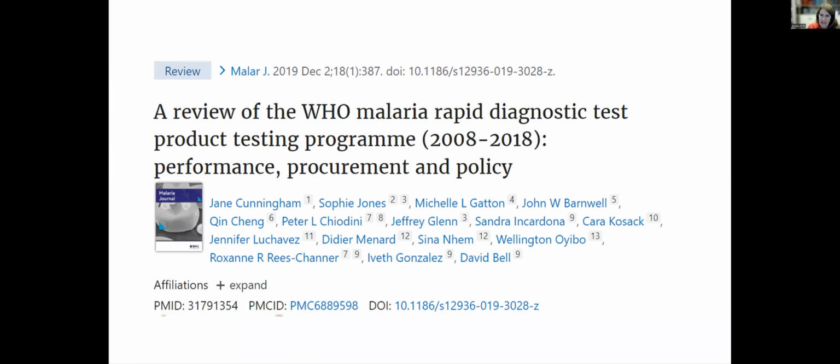So if you are in one of these settings where they're using one of the many rapid diagnostic lateral flow assays that are available, you should go to this particular publication or the World Health Organization's online materials where they've reviewed most of the commercially available tests. They're not all created equal. Some are very sensitive, some are less sensitive, some have a lot of false positives, some have a lot of indeterminate results. And this review and the ones previous really cover all of those differences. So wherever you are, look up the test that you're using so you understand how good it is.